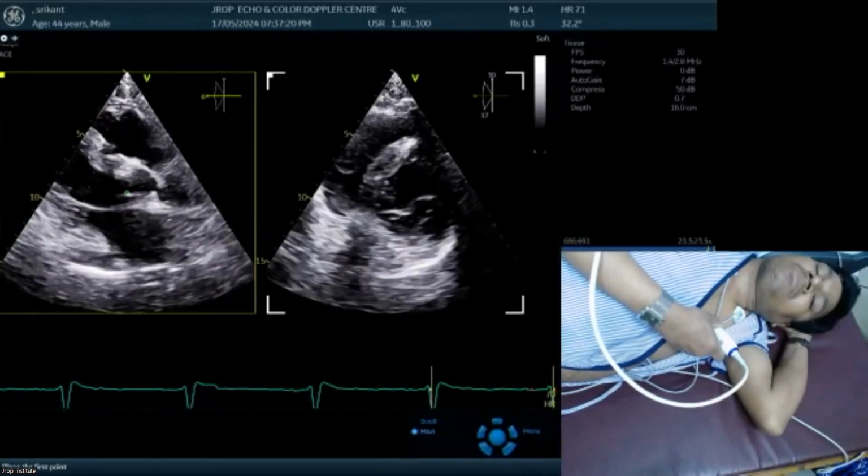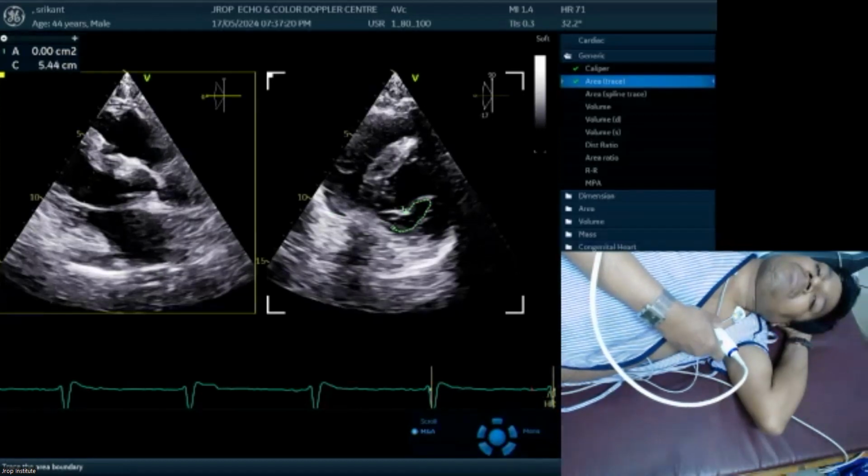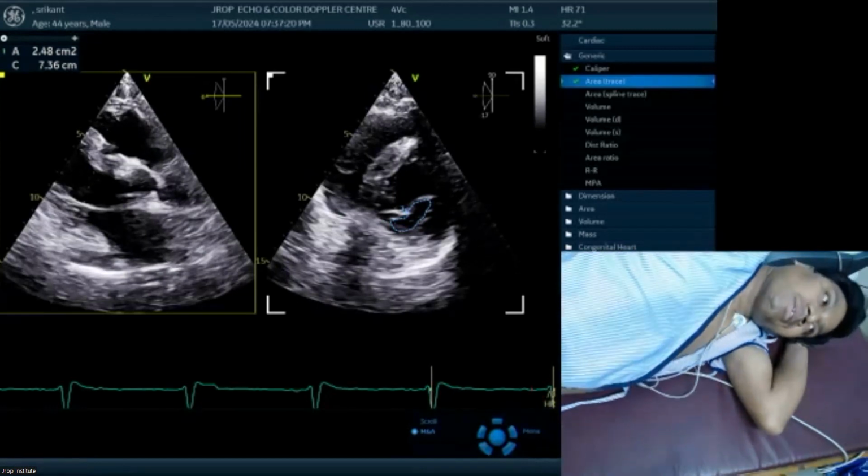With a caliper you can trace the mitral valve area. I'm showing you, this is not perfect, but this is how I can calculate the mitral valve area. And while calculating, we have to trace from the inside of the leaflet. That's what we have taught you, leading edge to trailing edge. This technology is available with 3 dimensions.